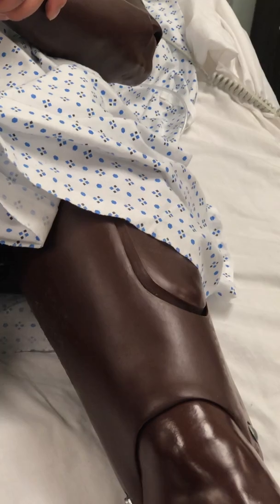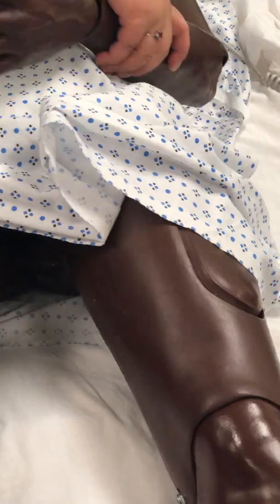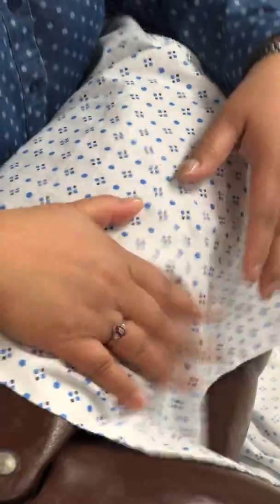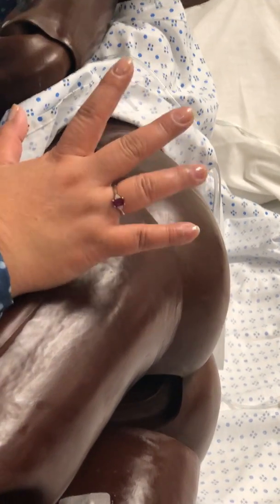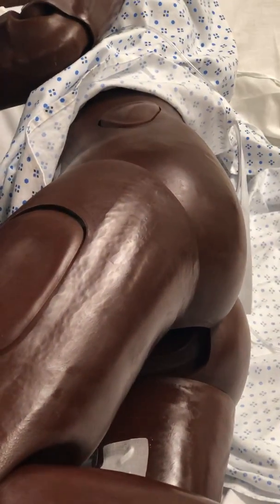Ventrogluteal, we ask the patient, it is better if the patient is facing you. So we can ask the patient to go sideways like this and flex the knees, because when it's flexed, the knees are relaxed and it's easier to go in. The needle goes in easier. So you can tell the teacher, if I'm using the left hip, I'm gonna use my right hand, all right? And vice versa, all right? Right hip, you use your left hand.